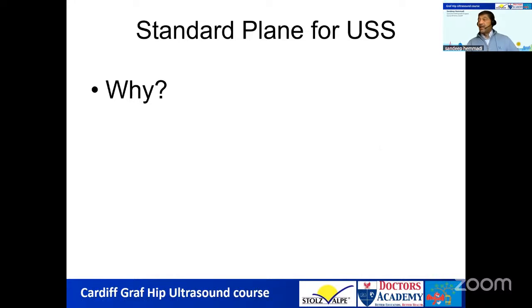So why do we need this standard plane? Because we need reproducibility. As I explained just as I started the talk, our femoral head is not round. Our acetabulum is not equally deep. So unless we define which part of the acetabulum you're going to get your ultrasound tomogram, for want of a better word, if you don't define that clearly, in the same baby on the same day, if you make your images slightly anterior or slightly posterior, you will get different measurements, and then your system will not be reproducible. So we need to define the standard plane to have a reproducible system.